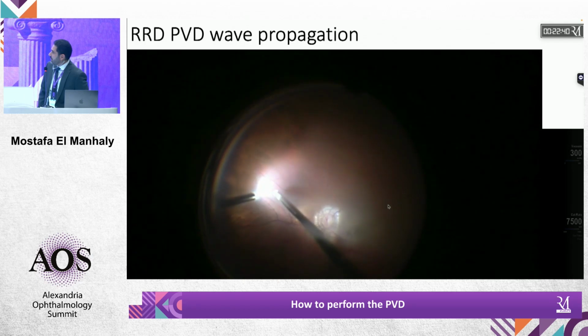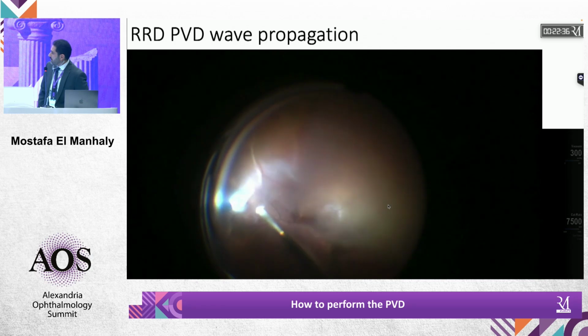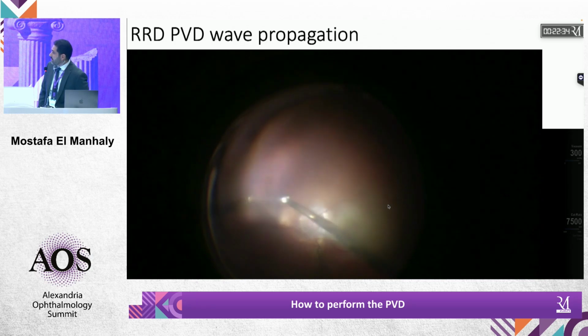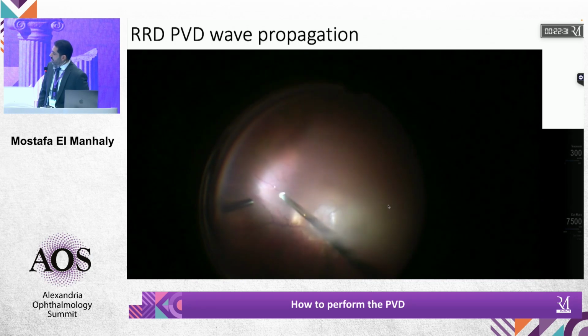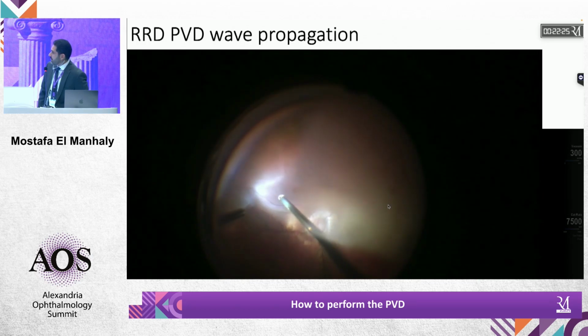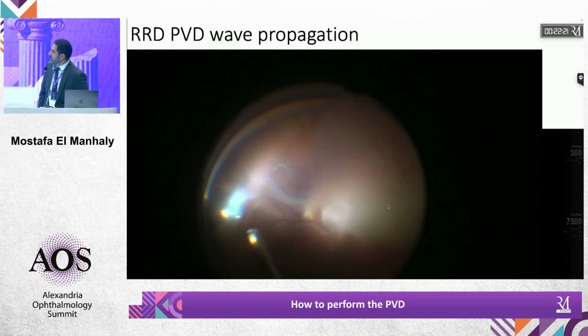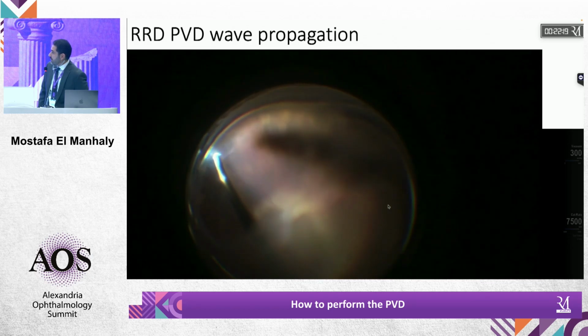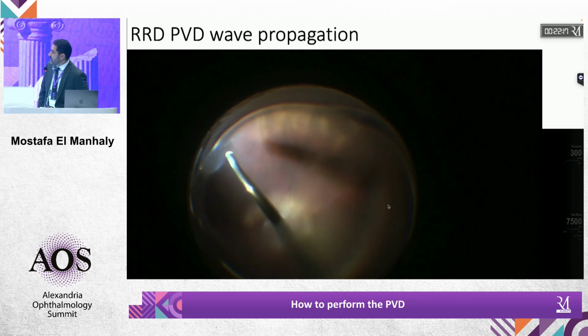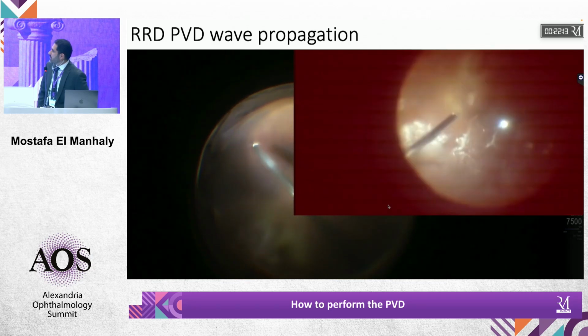The central area is my concern. I don't go all the way to the periphery because usually it's very difficult to detach the hyaloid there. Centrally, I will detach it under perfluorocarbon. I flatten the retina, then start detaching it. It gives me a second hand to stabilize the retina while detaching the hyaloid. In very highly myopic eyes, you don't have to go all the way to the periphery. You can sometimes shave it, but sometimes you get more damage while trying to pull more. So pulling on these patients is not a good idea. Perfluorocarbon is one good thing to use.